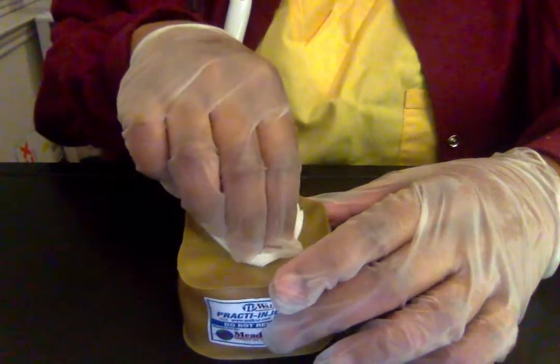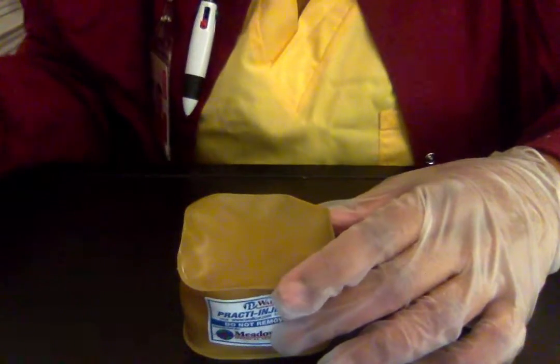Okay, then after that, I would just make sure to wipe, make sure there's no irritation, and that the patient is okay. And also with this one, like our last one, right, we need to document. I need to make sure I document where I gave that injection, what I gave, and how much I did give, so that the next person knows where to give and to not give the injection for the patient next time. So now that I have done that, we are done with our sub-Q injection.